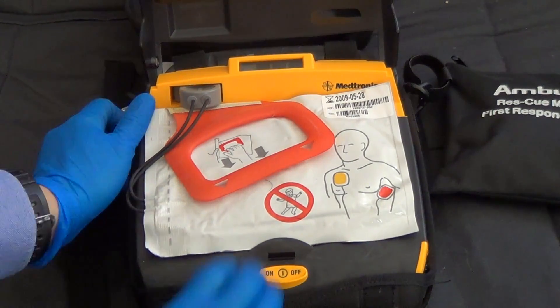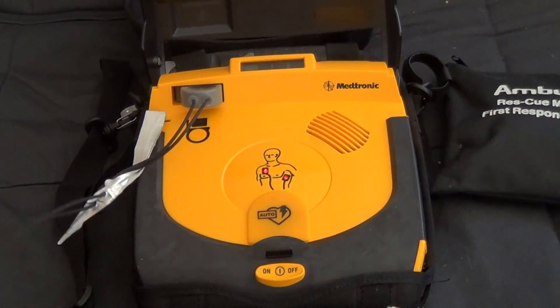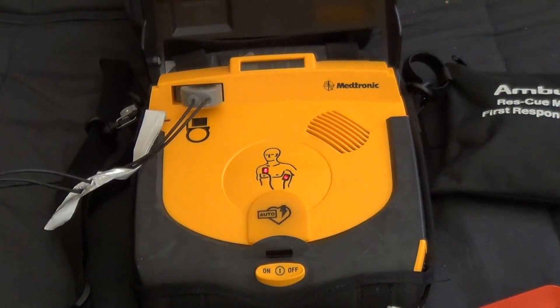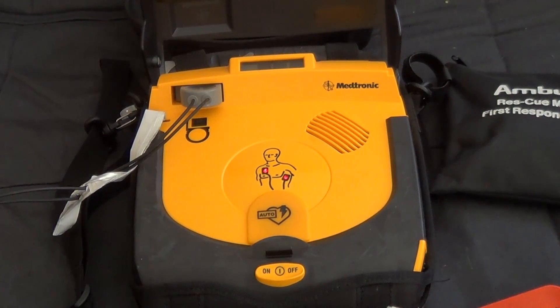Pull red handle to open bag. Look at pictures on pads. Peel one pad off blue plastic. Apply pad to bare skin, exactly as shown in the picture. Press pad firmly.